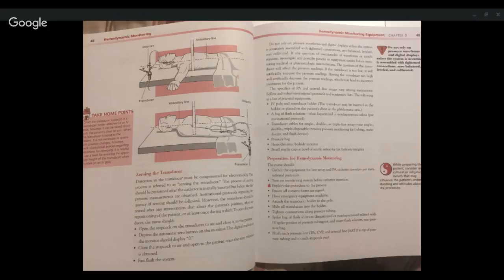Slide all transducers into the holder. Tighten connections along pressure tubing. Spike the bag of flush solution with the IV spike portion of the pressure tubing set, and insert the flush solution into the pressure bag. Flush each line to tip off pressure tubing into each stopcock port. Apply 300 mmHg pressure to the pressure bag. Inspect tubing, transducers, and stopcocks for air bubbles and remove any if present.